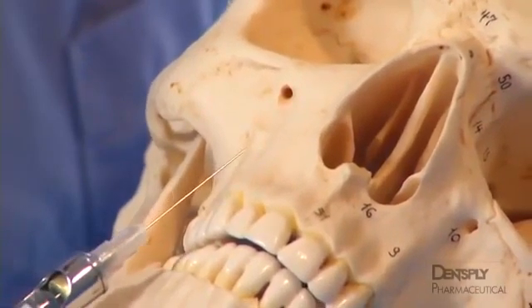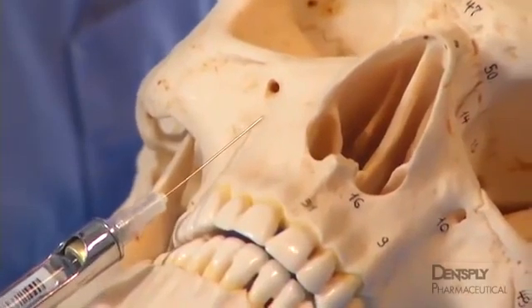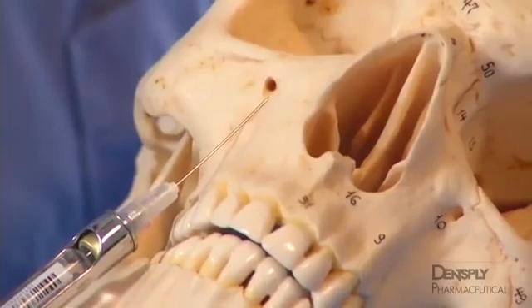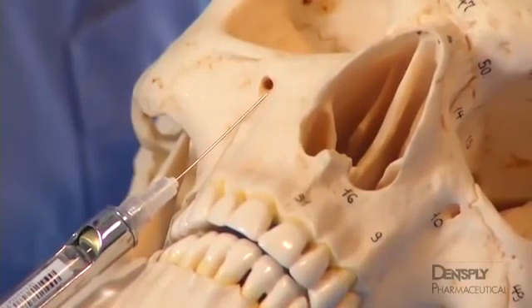First, if bone is contacted prematurely, the heel of the needle bevel will tend to glance gently off the bone without scraping the periosteum. Second, the spread of anesthetic into the foramen and canal may be aided.